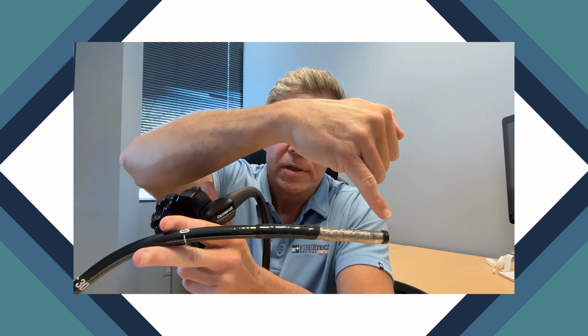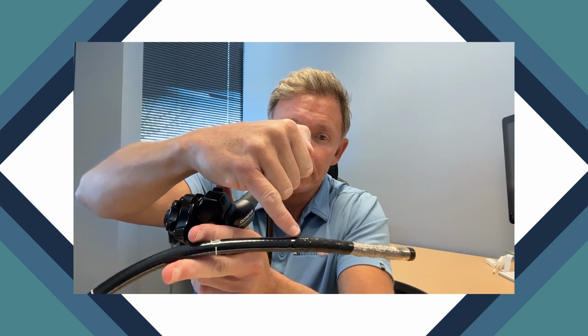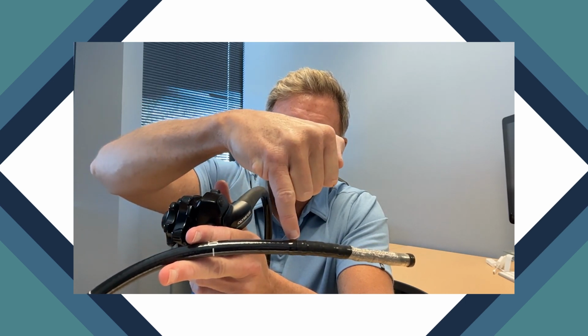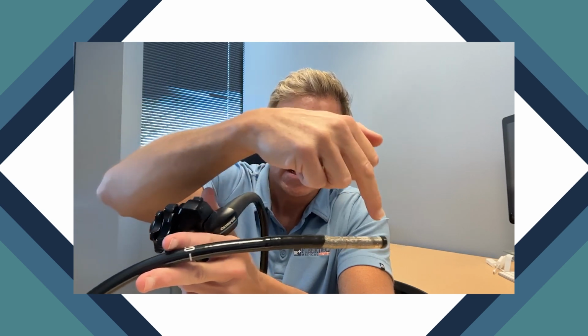And when they're looking at the bending rubber bending section, the epoxy seals, if they're going to do a preventative maintenance inspection, when the seals start to turn gray, opaque, there's chips in the epoxies, there's anything that they could visually see on the outside, should it go in for repair? Yeah, so that's a really good question that a lot of people don't understand. So again, right here, the seal on the top of this is missing because the bending rubber's been cut off. But if you look at the bottom here, you can see a shiny, just a small, about the size of my finger here. So when this bending sheath is put onto the scope, to help hold it in place and secure it to the scope, there's an adhesive ring at the bottom and there's an adhesive ring at the top.